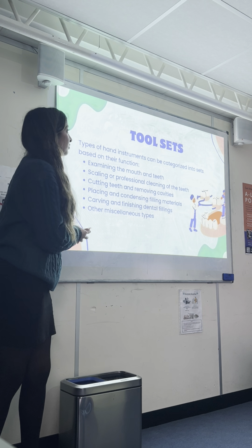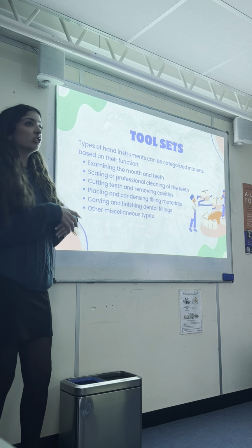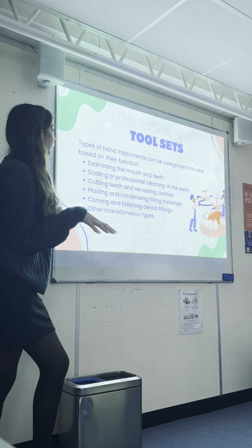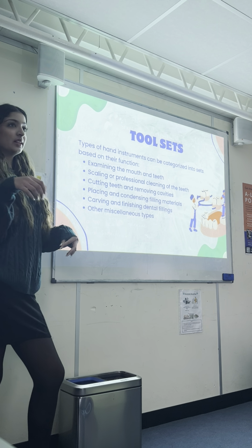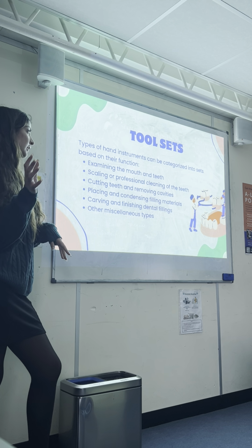There are different types of instruments, and they can be categorized into different sets. So they can either be for examining the mouth, or for cleaning it and scaling, or for removing cavities like extractions, or placing materials such as fillings and that kind of stuff.